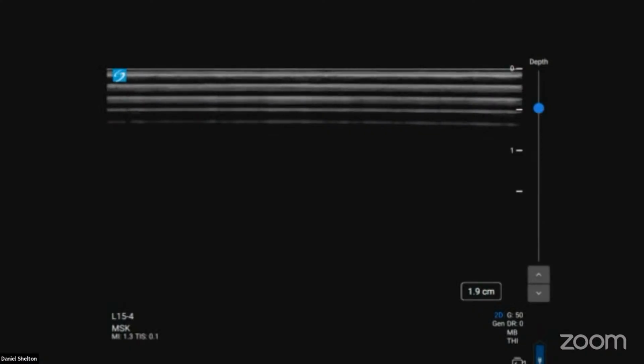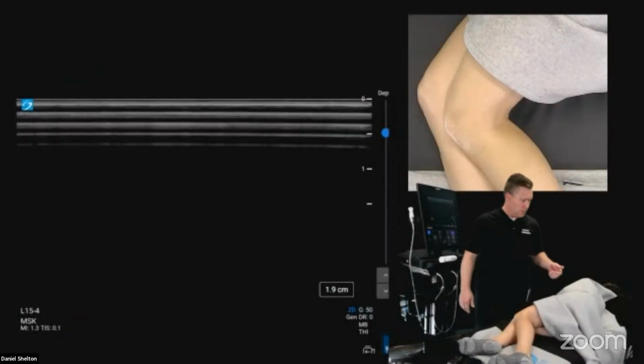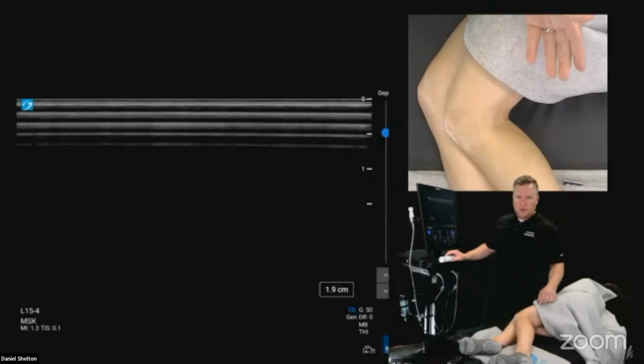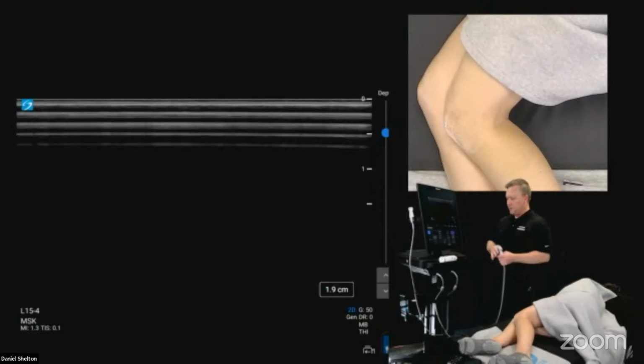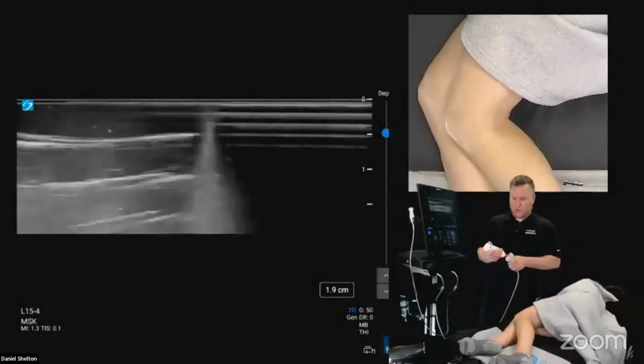All right. So, as you'll see here in just a sec, we've had a little bit of time go by and things have changed a little bit since we first hosted. So, similar setup, but we're going to demonstrate any of the live Q&A with the Sonosite ST. So that would be a difference that you're seeing since we were live on that first recording. So happy to take your questions.